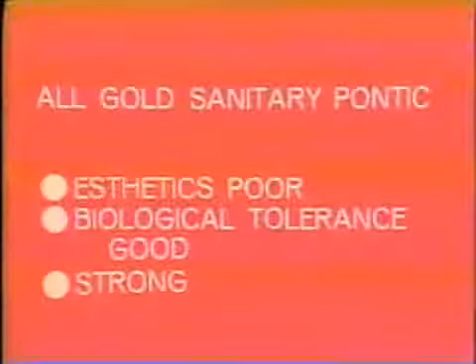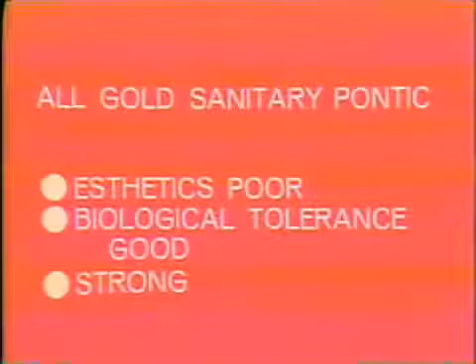Well, just to summarize the main points of the all-gold sanitary Pontics, the aesthetics are not good. The biological tolerance of these, so far as the tissues of the mouth are concerned, if they're well polished and a good casting, is good. They have the great advantage, of course, of being strong. They resist the many forces that fall upon them in the posterior mandibular region extremely well.